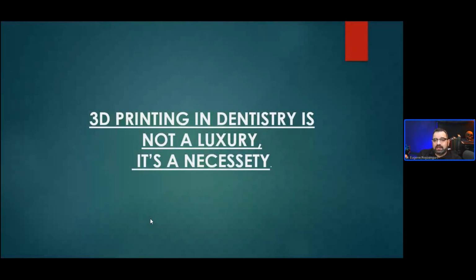A lot of clinicians are getting intraoral scanners because it makes it easier for them. From the denturist standpoint, when you've got a patient with severely periodontally involved dentition and you need to take an impression, yeah, there are ways you can do this in analog. But sometimes it's just a lot easier to take a nice scan and be done with it. And then they will end up sending that scan to a lab. And if you are the one working with that particular account, they're going to be sending it to you.